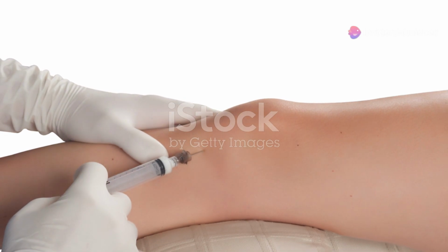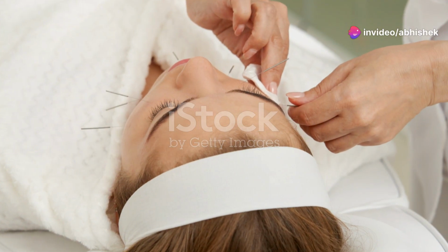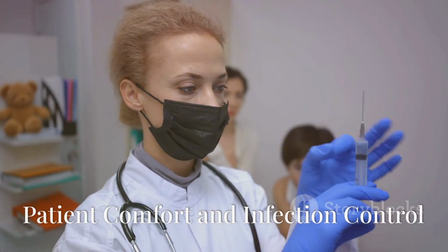Needle removal. Withdraw the needle quickly and apply gentle pressure to the injection site with a clean gauze pad. Finally, disposal. Dispose of the used needle and syringe immediately in a sharps container.